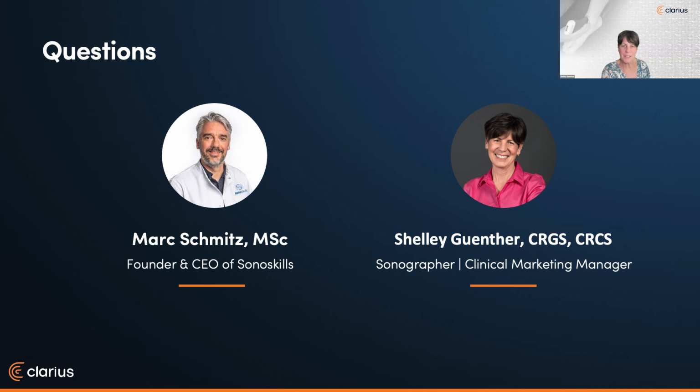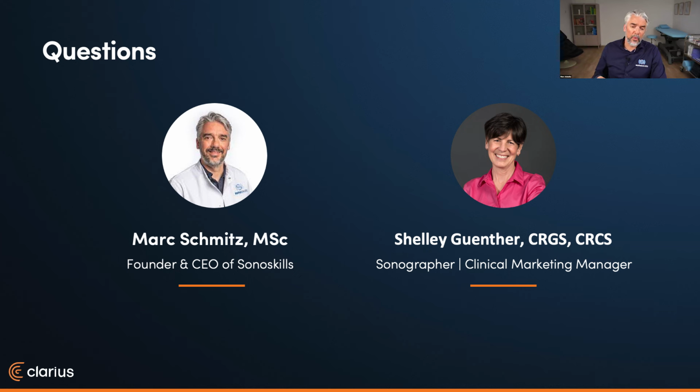Awesome. There was a question about the approach for neuroma exam. Do you ever do a plantar neuroma approach? The exam I showed, the Morton's neuroma, is a technique that I do regularly in clinical practice. If you come to the ankle and foot boot camp, we have our best ankle and foot sonographers, worldwide renowned. They will be teaching it, and they will also show you other protocols to examine neuromas, fibromas.